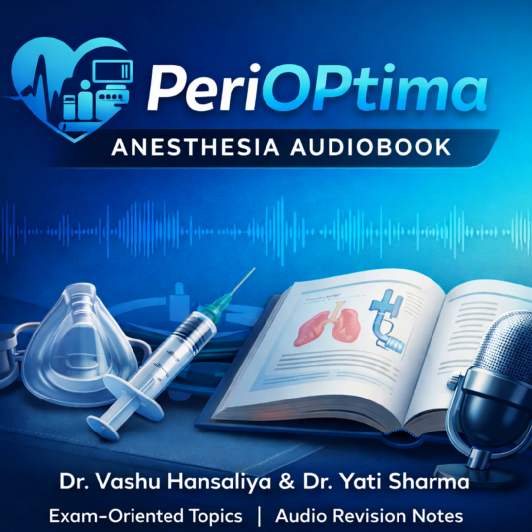We should probably briefly mention the other categories in Miller's system just to show comprehensive knowledge, even if they aren't the clinical workhorses. Yes. For a complete answer, Miller also defines: 1. Cuffless anatomically pre-shaped sealers. The textbook example here is the streamlined liner of the pharynx airway, or SLIPA.